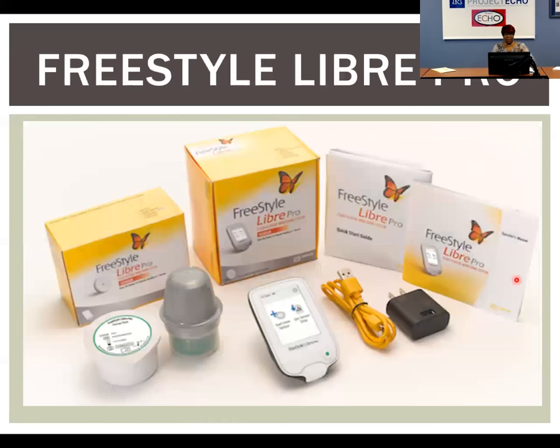The Freestyle Libre Pro comes with all the parts that you see here. And as I said, it is the newest device to the market. So what you see for the Freestyle Libre, and you see a little more in the other picture, this is the introducer here. The actual transmitter is in this container. And then the meter is the activation device.